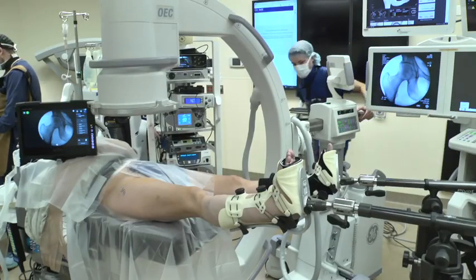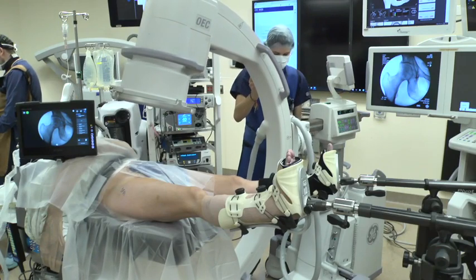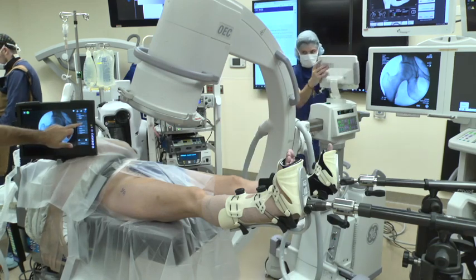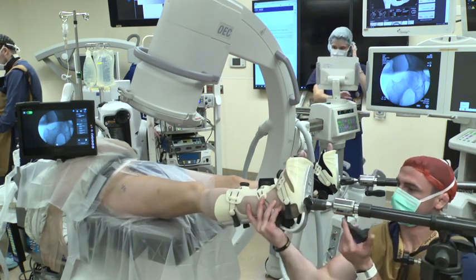Initial fluoroscopic preoperative images are then obtained. An AP image is first obtained, followed by a 15-degree angle toward the feet and 15 degrees rolled back toward the x-ray tech. The hip is then imaged in neutral rotation and extension, and 30 degrees of internal and then 30 degrees of external rotation.